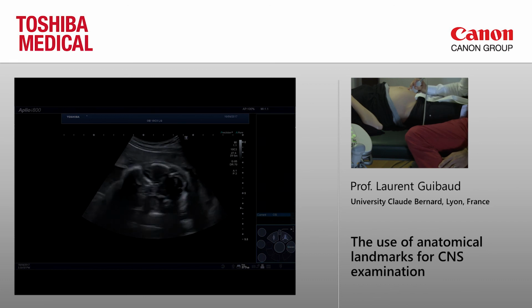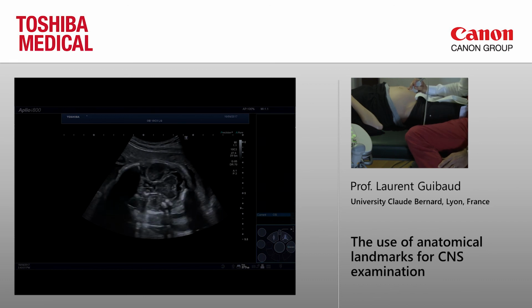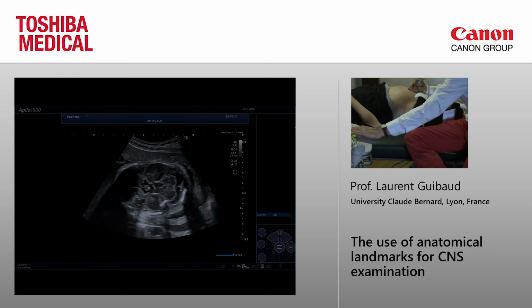Feel free to ask. And for the posterior fossa, you see clearly the fourth ventricle, which is here. You see the echogenicity of the vermis, and you see the two hemispheres. And you see that for the fourth ventricle, the AP diameter is superior to the transverse diameter. If the AP diameter is longer than the transverse diameter, and you have hexadactyly, what's your diagnosis? So, yes.